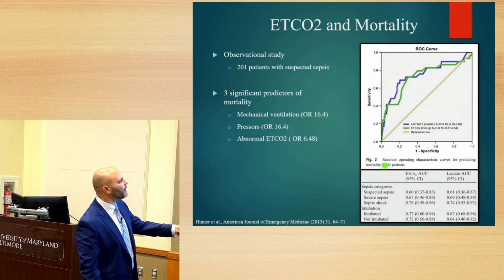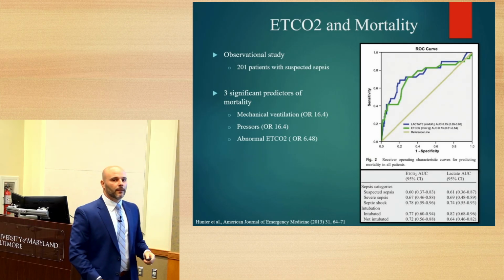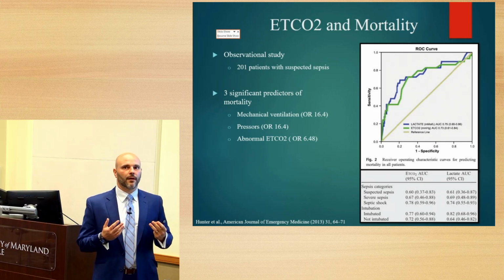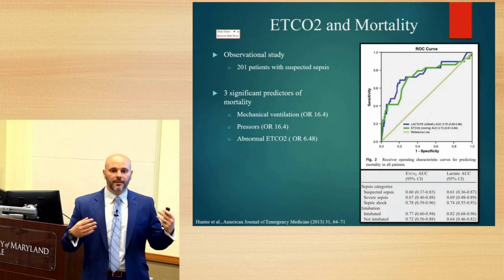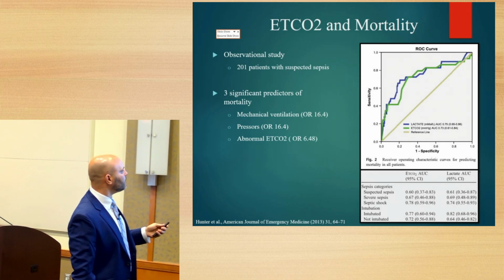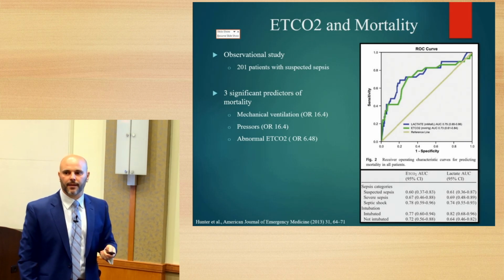And then one more time for good measure. So end tidal CO2 correlating just as well as lactate in mortality. Okay, so end tidal CO2, in my opinion, is a non-invasive lactate, the way that I'm viewing this now. So can we utilize that in the pre-hospital setting or early in the resuscitation to see how this patient's perfusion is doing? All right. And this is the last study showing that the predictors of mortality were mechanical ventilation, pressors, and then a low end tidal CO2.